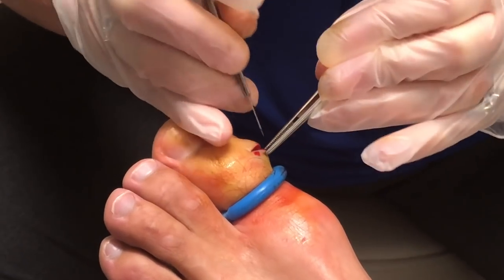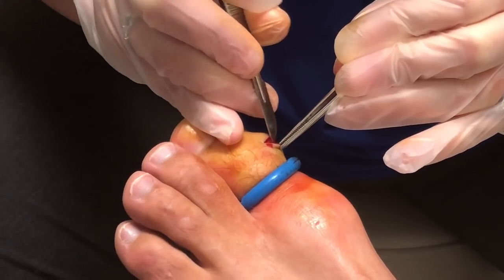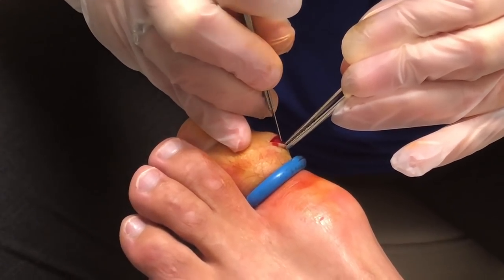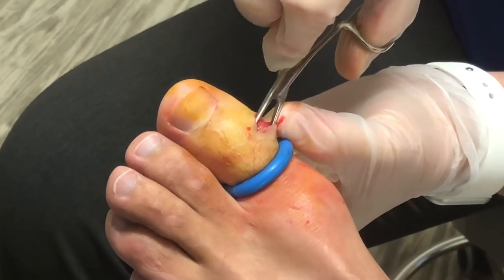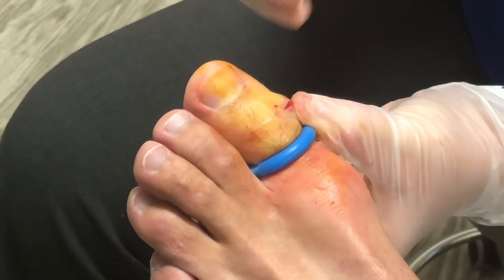Now we are trying to free the skin up so it will expose the soft tissue mass. The important part is to make sure we free all the tissue up — that way you can actually grab it.